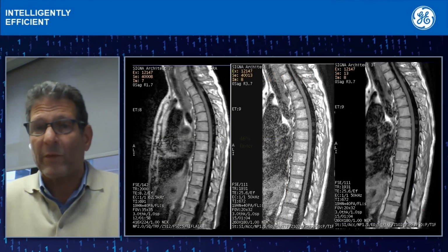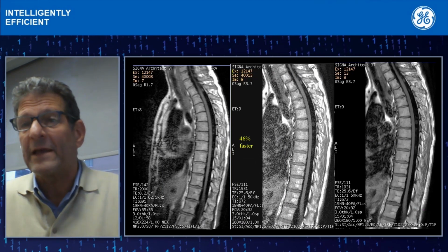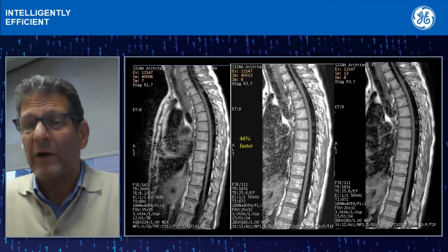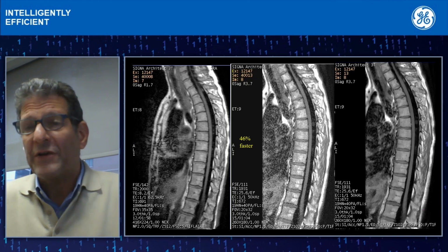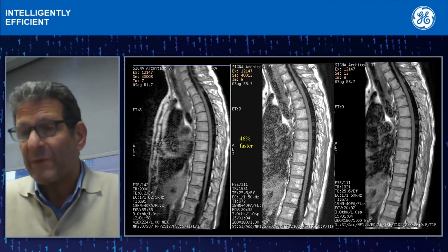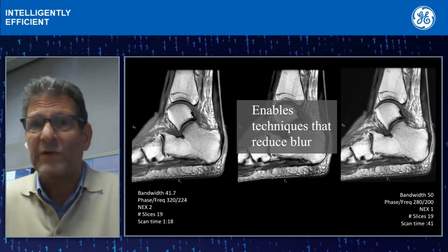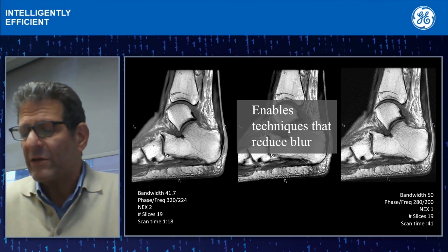And I think this is something you see across the board. On the left-hand side, believe it or not, was what we were apparently doing for our thoracic spines. In the middle frame here is our new approach. By the way, the image on the left took 2 minutes. The image in the middle takes about 1 minute. But you can see the new approach has got a lot of noise because we've really bumped the resolution here with this rectangular field of view. Notice how spectacular the final result is with the Recon DL. And that is probably the best looking thoracic spine image I've generated, and it's generated in a minute, which is really remarkable.